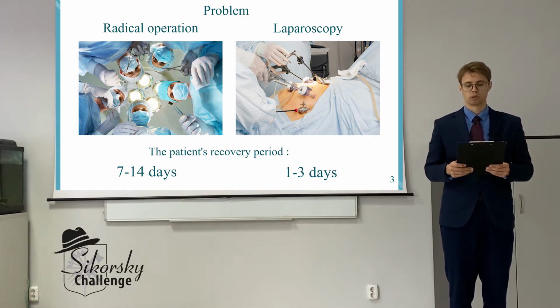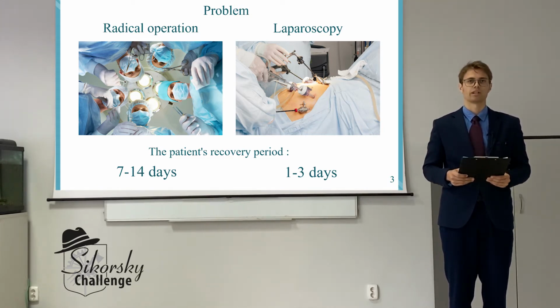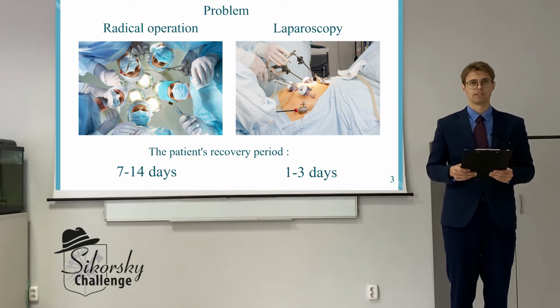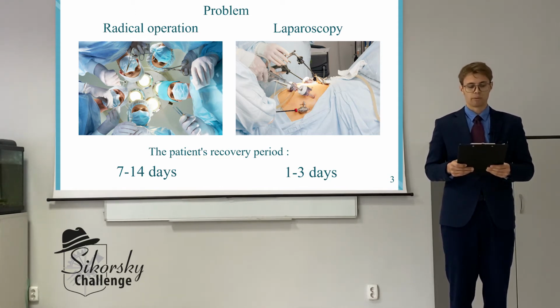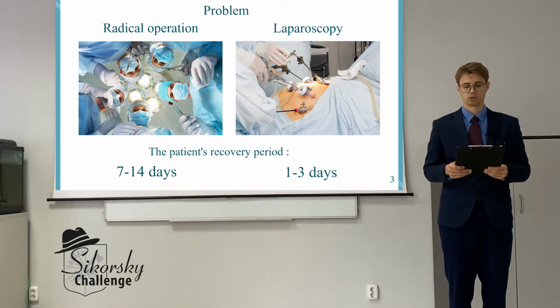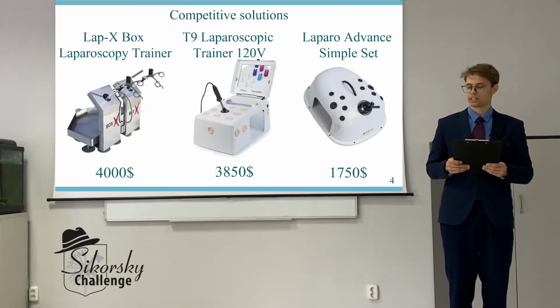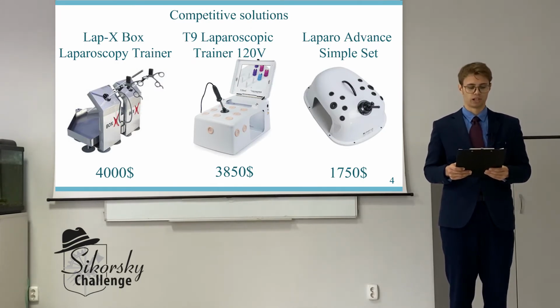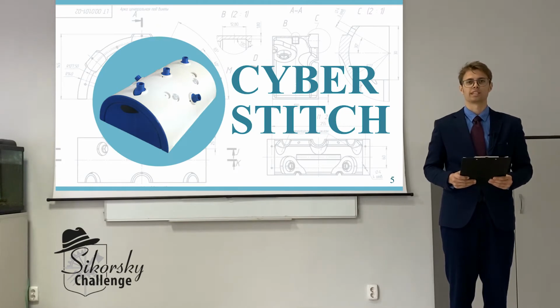The main advantage of laparoscopic surgery is the rapid recovery of the patient's body. The length of stay of the patient in the hospital after the classic operation using dissection of the interior abdominal wall is from 7 to 14 days, and after the application of minimally invasive laparoscopy, this period can be reduced to 3 days. We analyzed the existing simulators for laparoscopy and took into account all their shortcomings. The result of this work is the first prototype created by us.